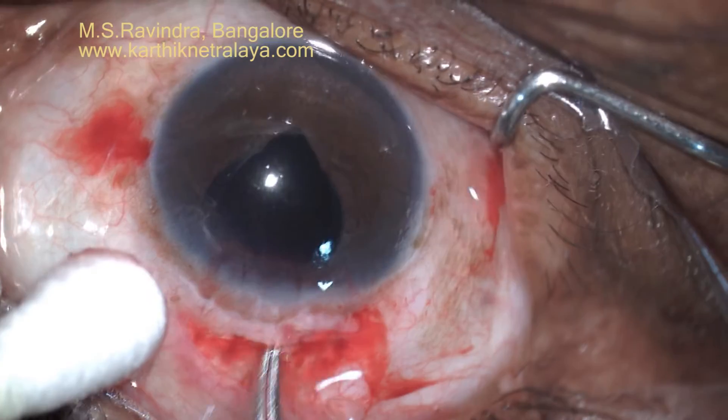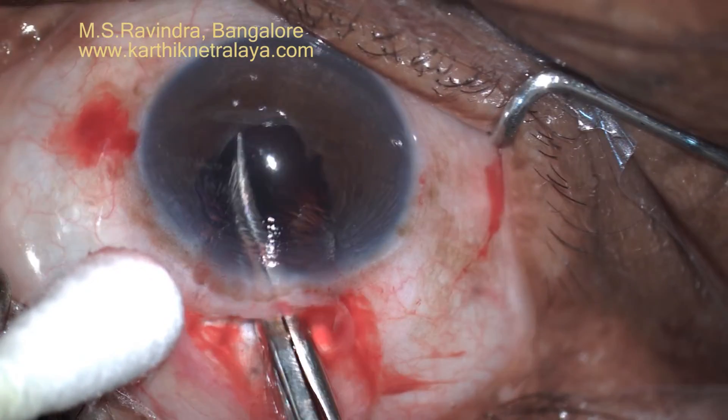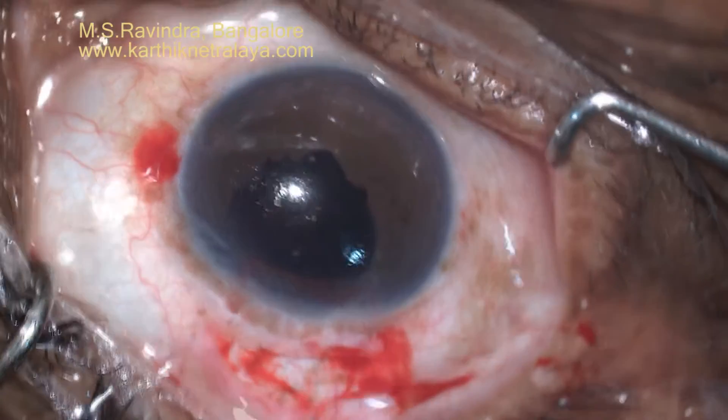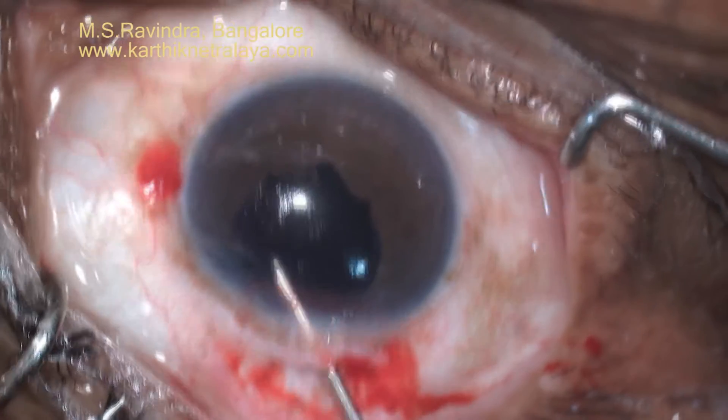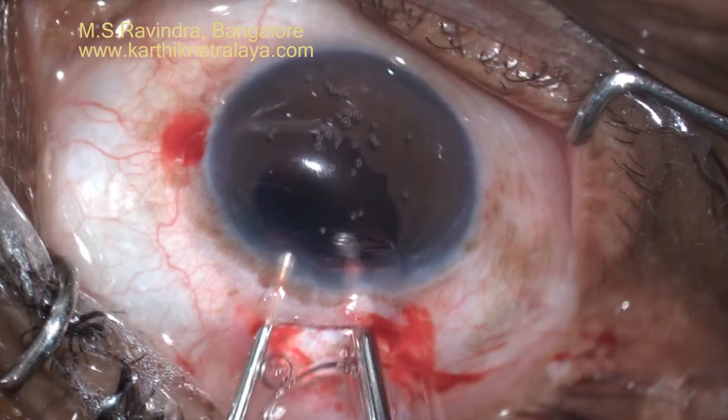As soon as the anterior chamber was entered, the vitreous presented. I did some sponge vitrectomy, then requested the machine vitrectomy, and made a radial cut to enlarge the pupil downwards. It was an up-drawn pupil.